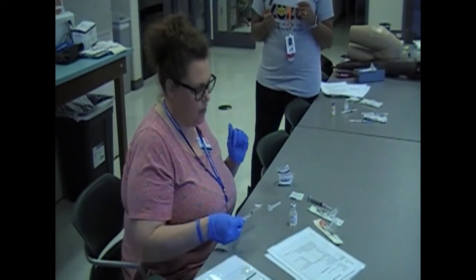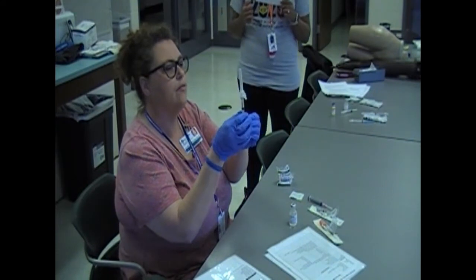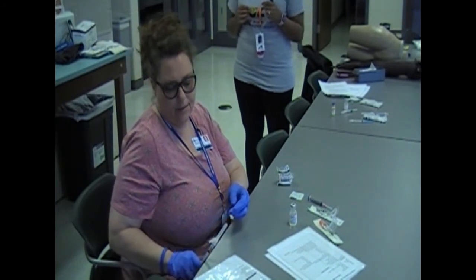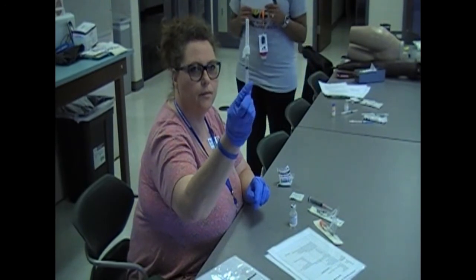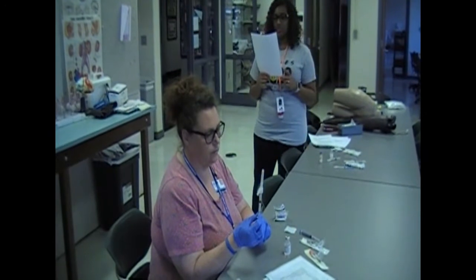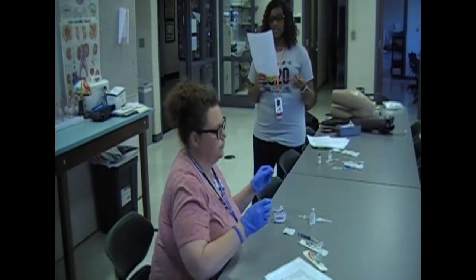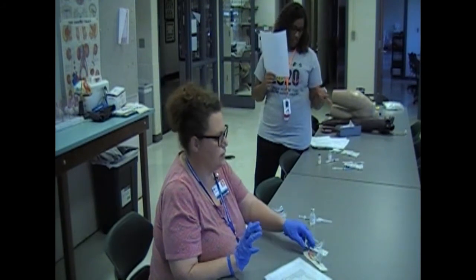See how I did that with one hand? Then I'm looking for air bubbles. Like she said, you can flick it, you may have to bang it. But I have no air bubbles. You will repeat this, which is steps 4 through 9. So your second med check, cleaning the top, maintaining sterility as you open your needles and syringes, and drawing up your meds for all 3 medications.